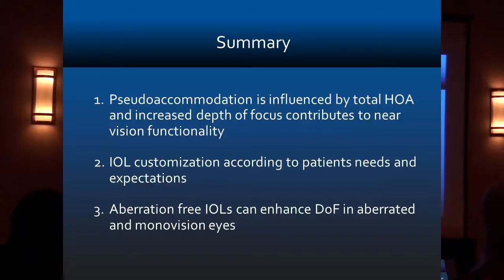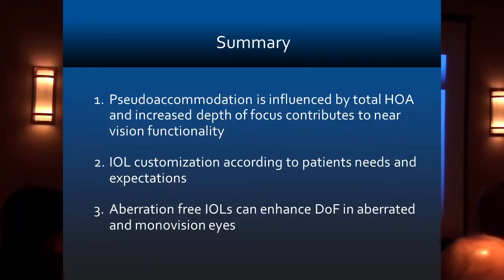near vision functionality. In my practice, I like to customize IOLs according to patients' needs. I don't do one-size-fits-all, especially with monofocal IOLs. I like to look at the cornea, look at the high order aberrations, internal optics to select the best IOL for that specific patient. Aberration-free IOLs can enhance the depth of focus, especially in highly aberrated eyes.